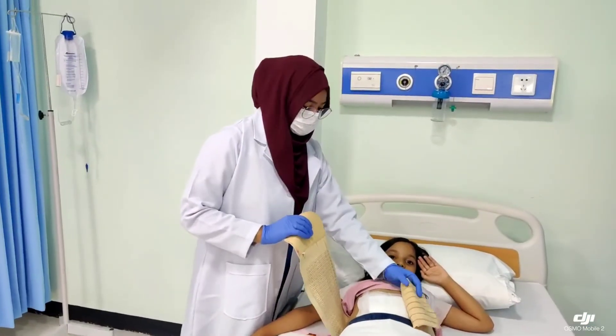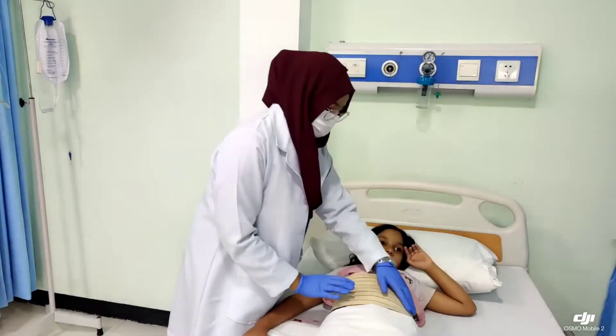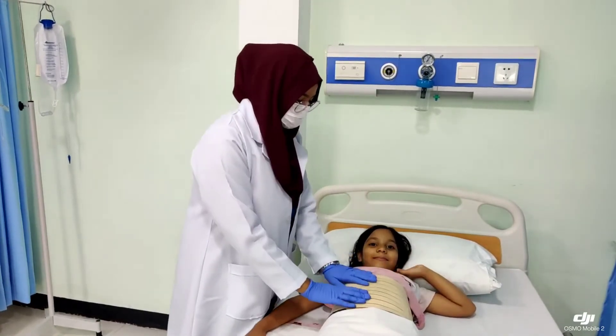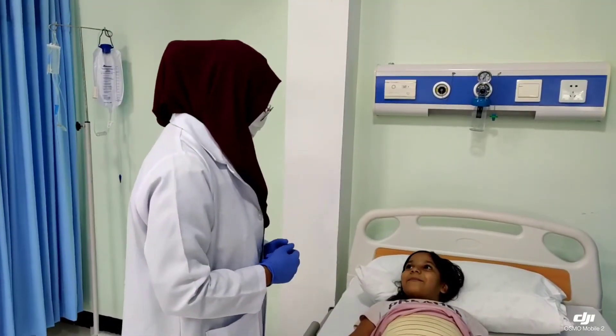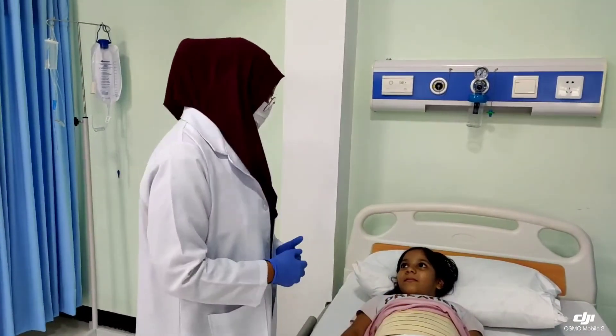As you can see, this is done to hold the wound dressing. And even if this is a little bit tight, it won't affect the patient's breathing, so it will be fine. Are you comfortable? If you want to tighten it or loosen it, or if you're having any difficulties, please tell me.